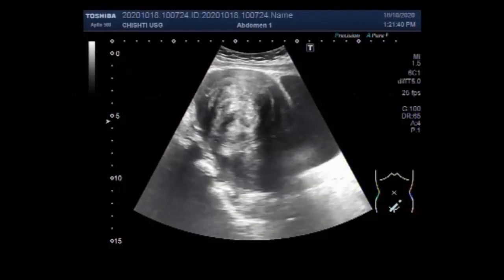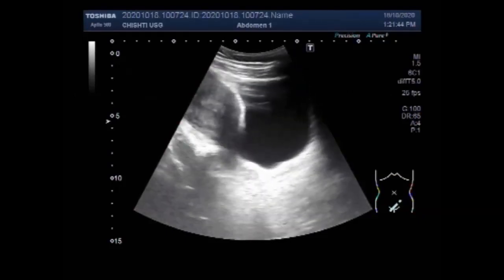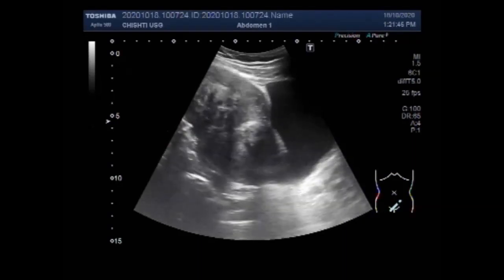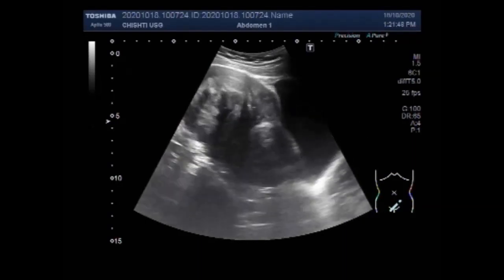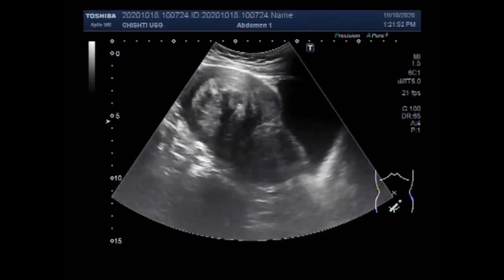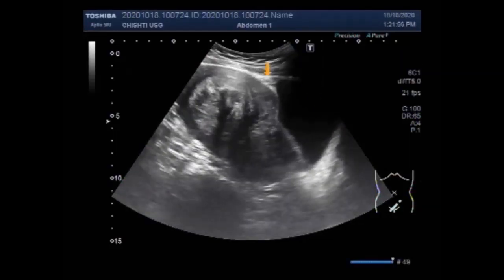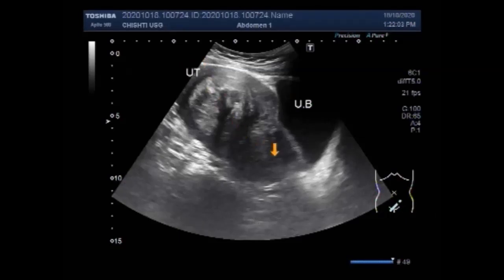You can see a large fibroid in the distal and middle portion of the uterus. It looks to be a pedunculated fibroid. It is round to oval in shape and has slightly heterogeneous echo-density. This is the uterus, this is the cervix, and this is the uterine mass fibroid.